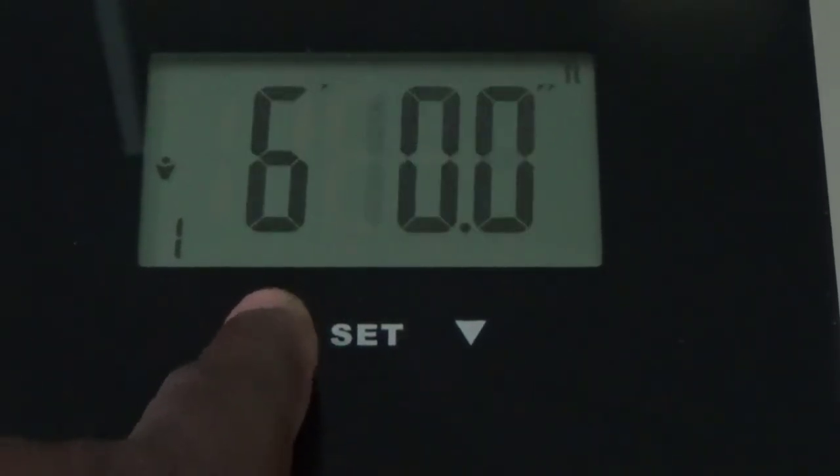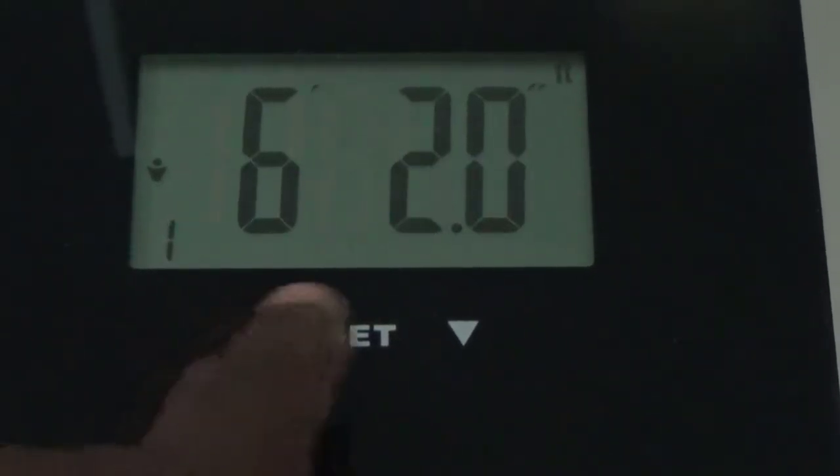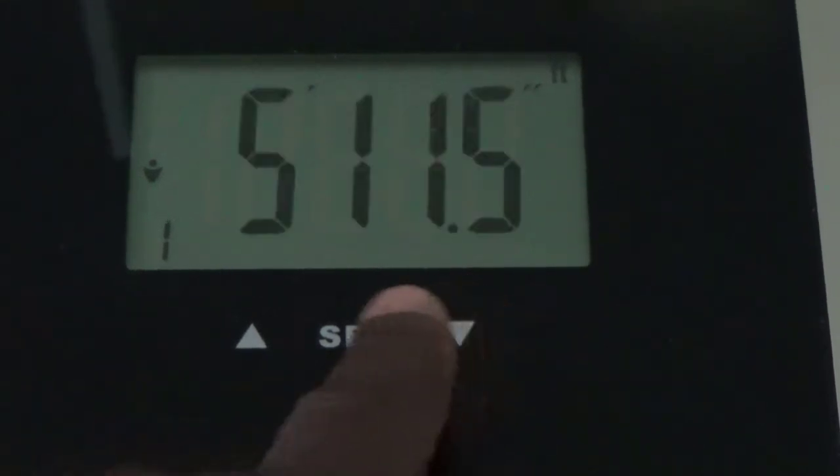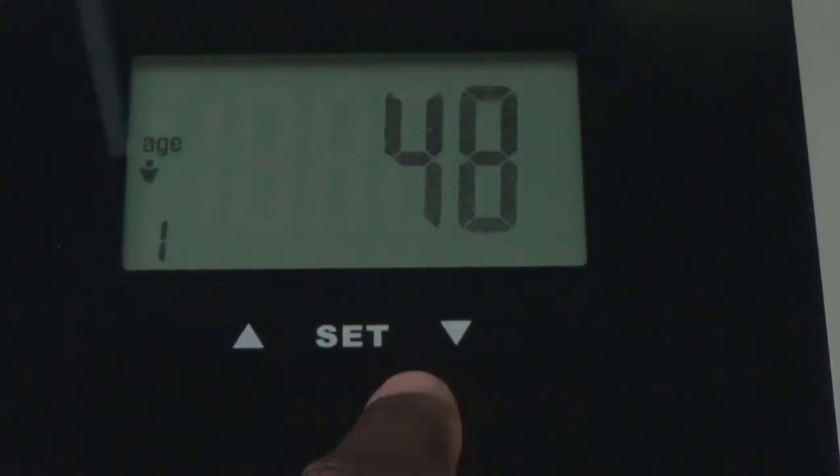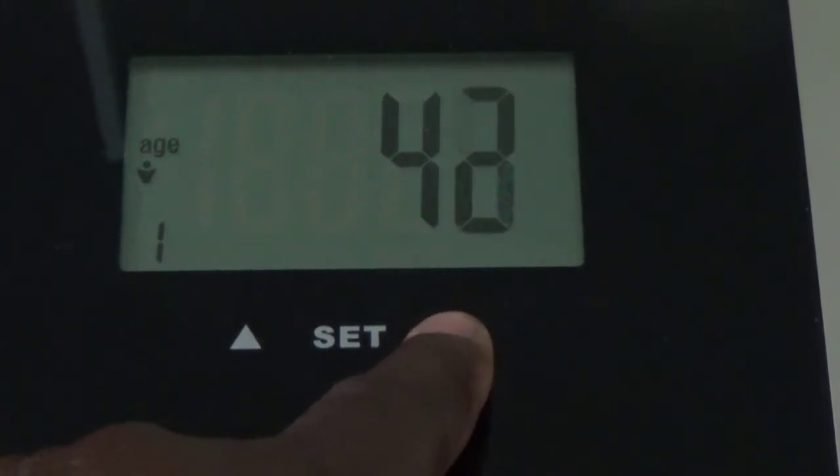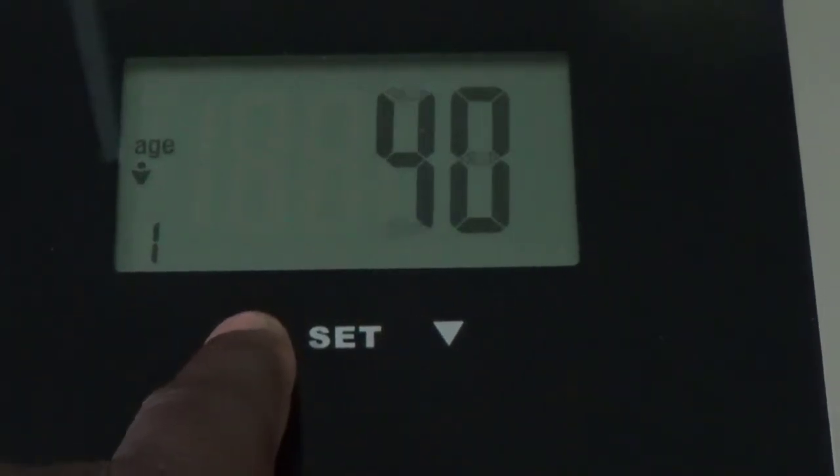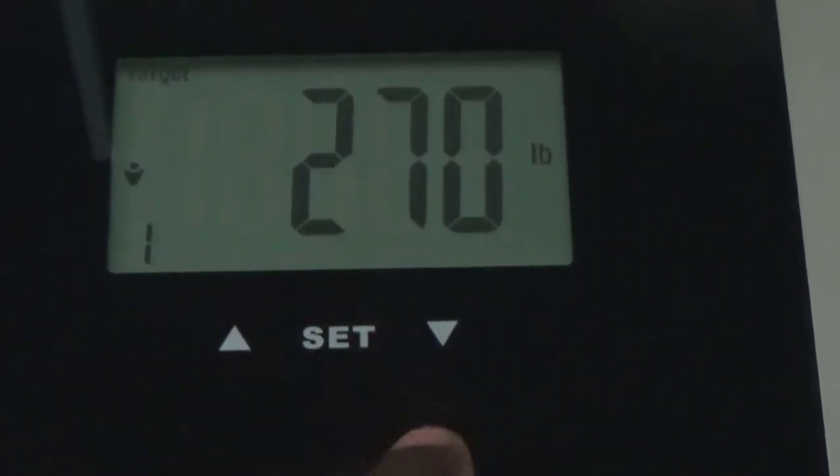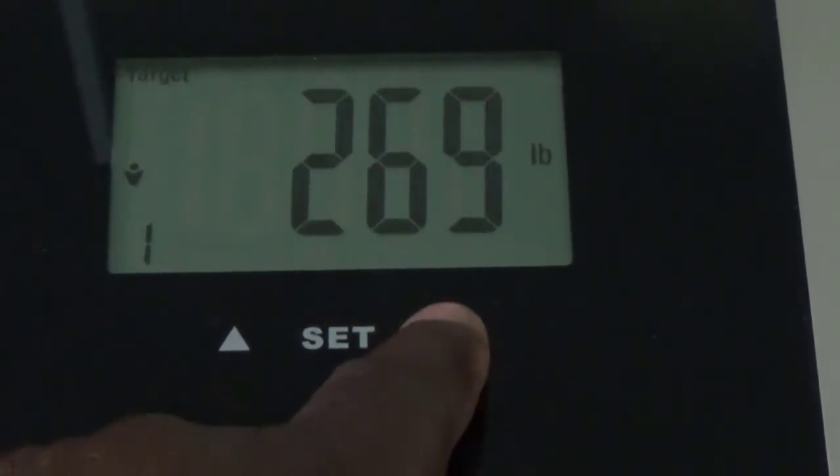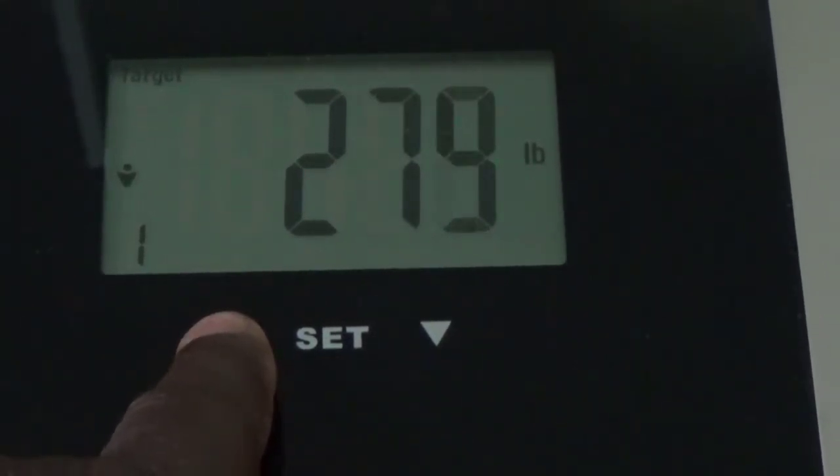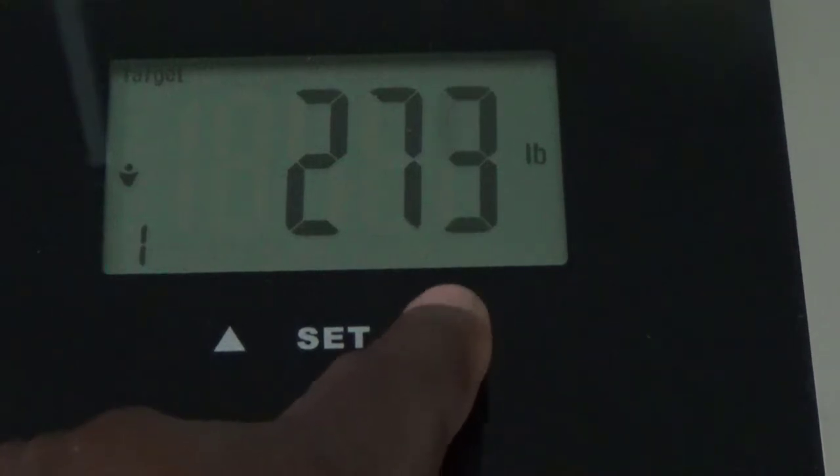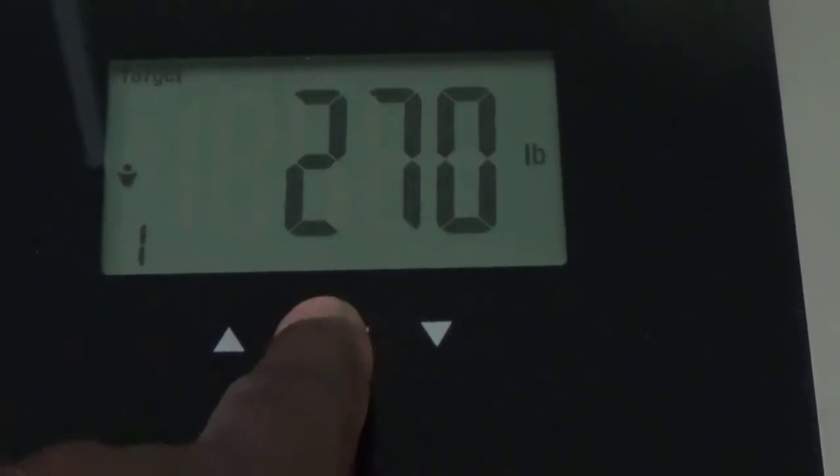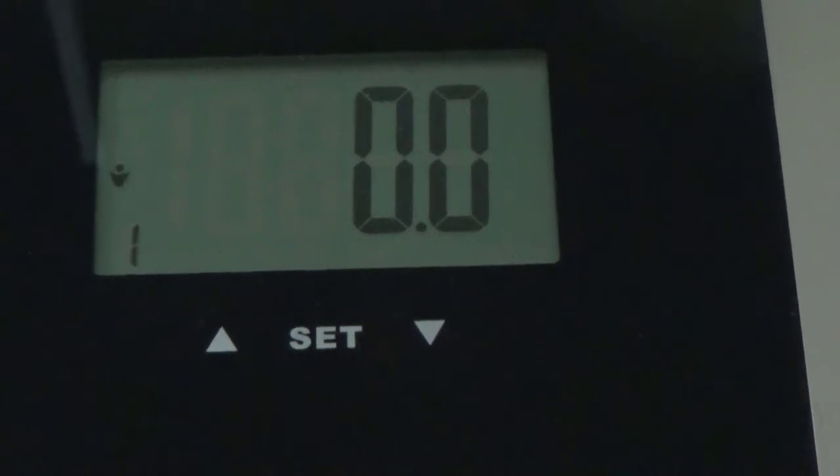Next you go to your age. Just hit your up or down and set. Mine's at age 48. And your pounds, just go up or down. You can hold the button, it'll go fast, or you could just hit it one at a time. I'm gonna set mine at 270, since I weigh 270.2. Hit set, and that's it.